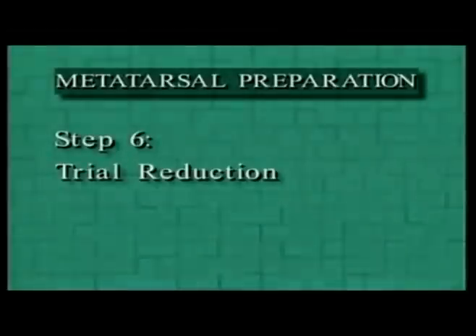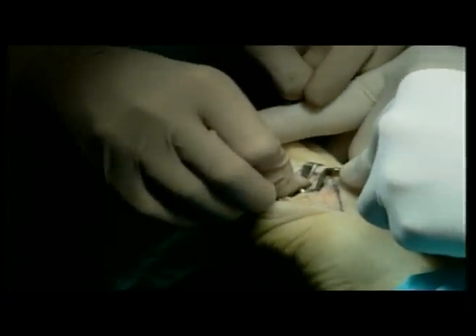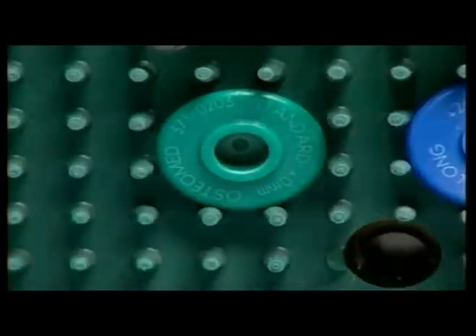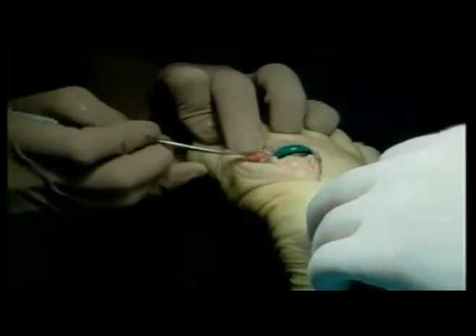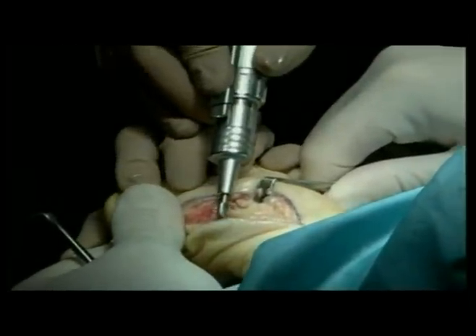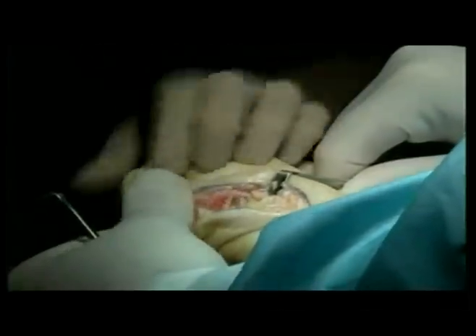Step 6: Trial reduction. First, insert the appropriate sized metatarsal stem trial. The stem trials are sized small, medium, and large. Next, insert the appropriate sized metatarsal head trial. The head trials are sized standard, long, and extra long. For ease of use, the heads are color coded: green for standard, blue for long, and red for extra long. Check the joint for range of motion and stability. Use a saw, rasp, bur, or rongeurs to remove excess bone around the trial components to reduce the potential for damaging the actual implants once they are in place.